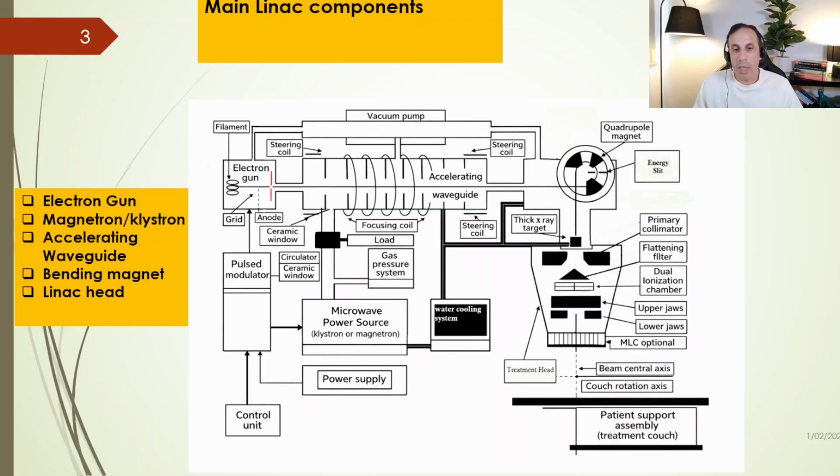In high energy linacs, electrons must be redirected to the patient. What it means is that the electrons coming out of the accelerating section cannot hit the patients, and they should be redirected.